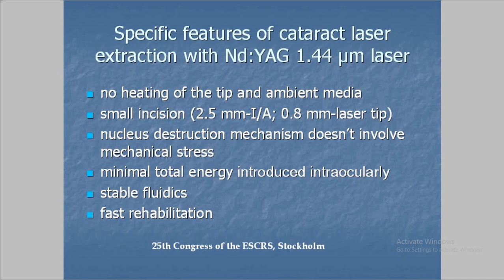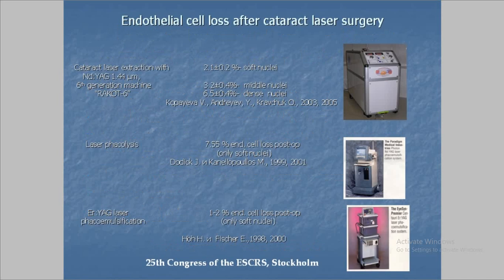What is important is that the nucleus destruction mechanism doesn't involve mechanical stress, and I will also mention this later in my little discussion. Minimal total energy is introduced intraocularly. The system is characterized by stable fluidics with no microcollapses of the anterior chamber, like we sometimes see in microincision phaco. And what we see clinically is very fast rehabilitation of the patients.